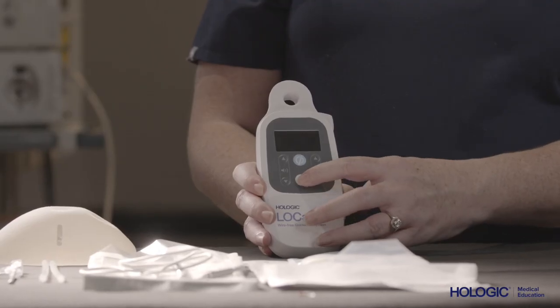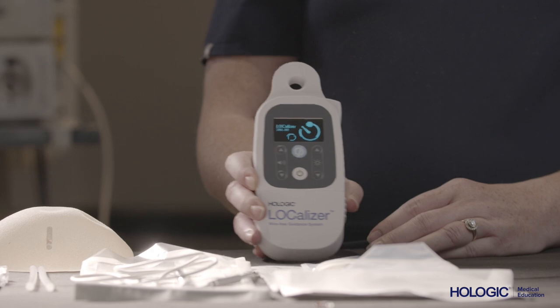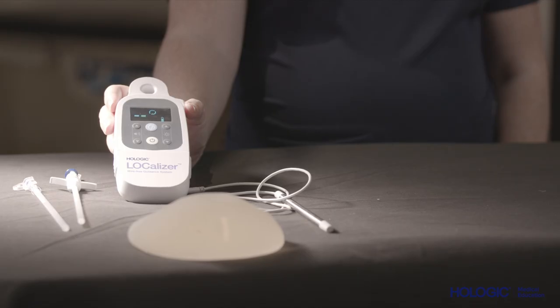After turning the reader on, the device self-calibrates and will show a battery life indicator and a small circle or loop at the top of the screen. This means that the loop probe is ready to use.